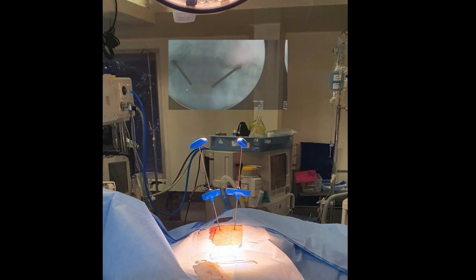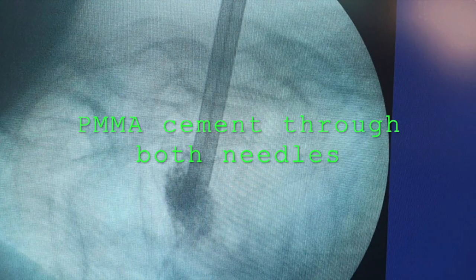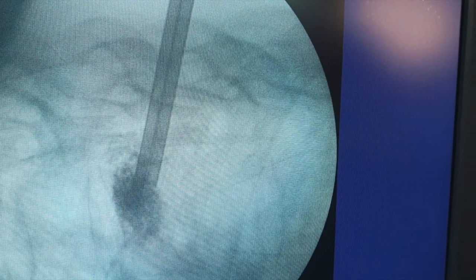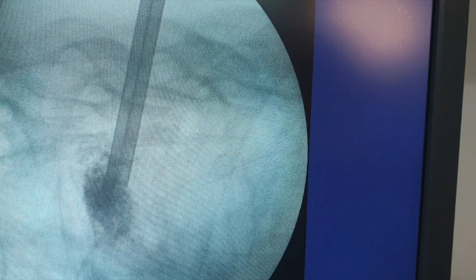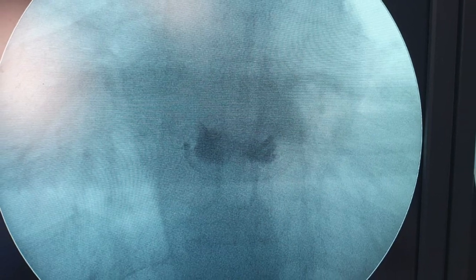The needle is placed on both sides. The Jamshidi needle is within the vertebral body within the pedicle, and bone cement is made and injected through the Jamshidi needle into the vertebral body.